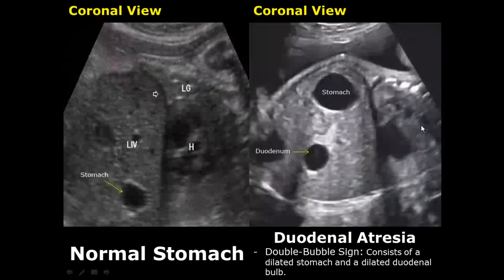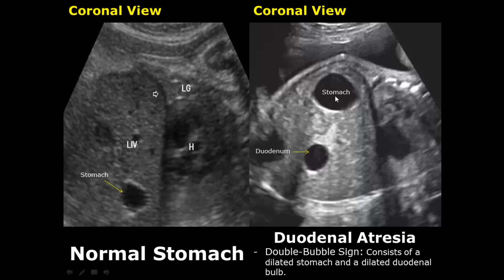Here is a coronal view of a double bubble sign. The stomach and the duodenum are both dilated in the setting of duodenal atresia.